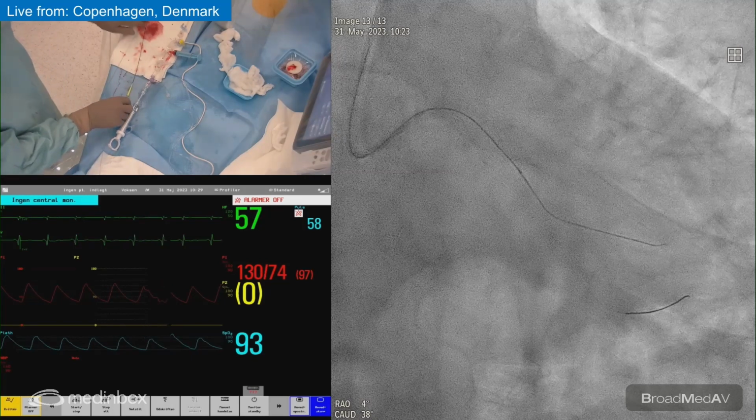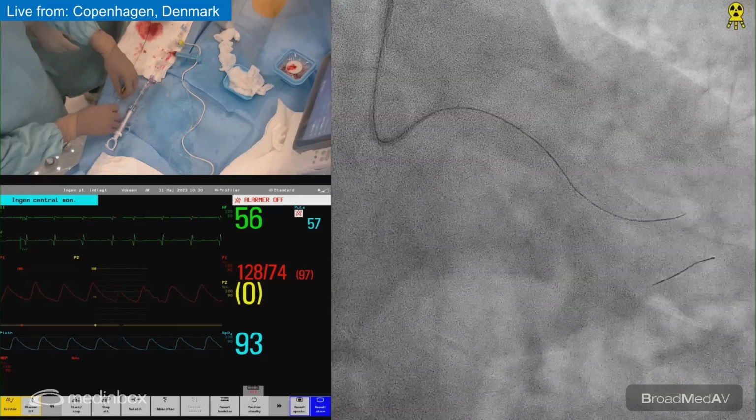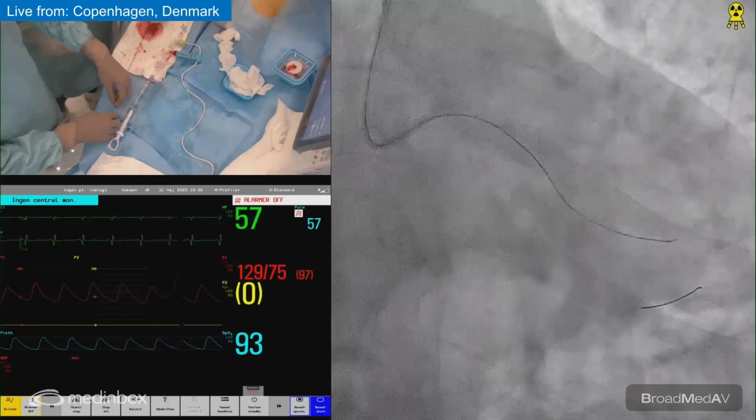Yeah, I can do it, Frans. I can help. Yeah, I will do that. Make some flow.